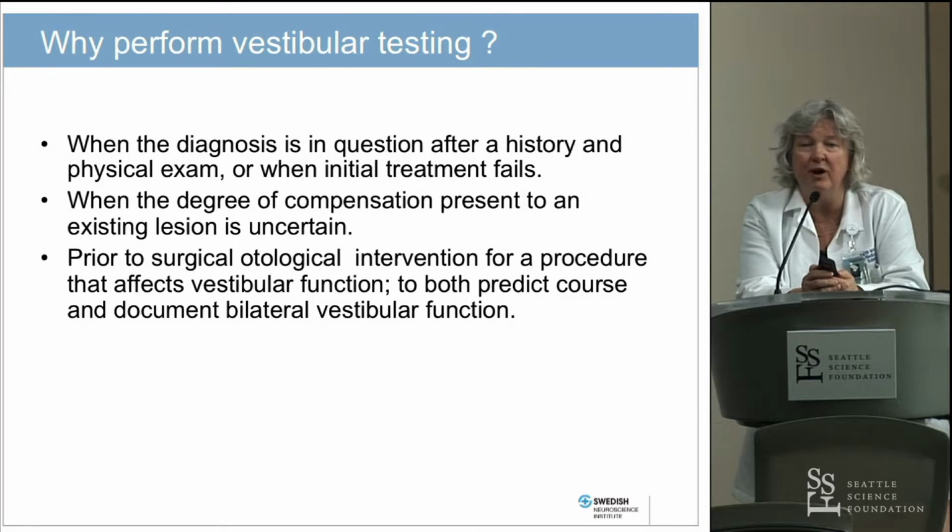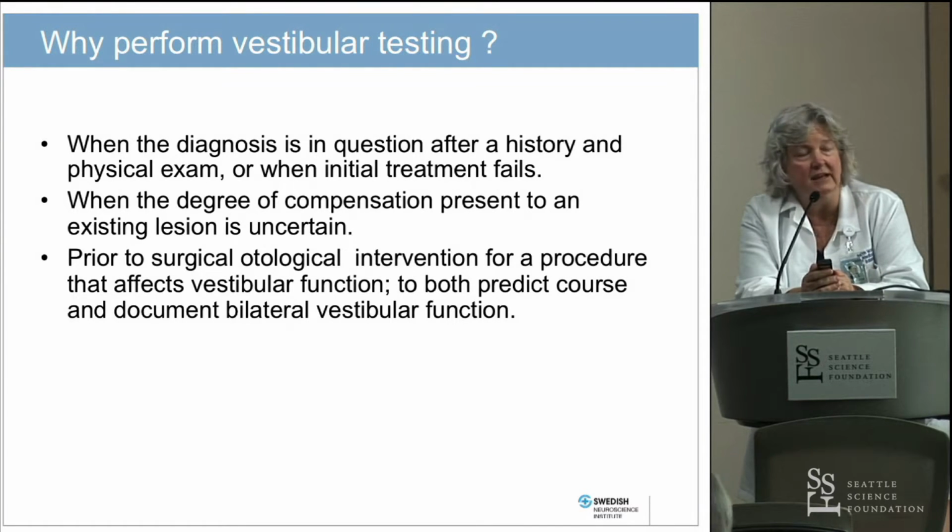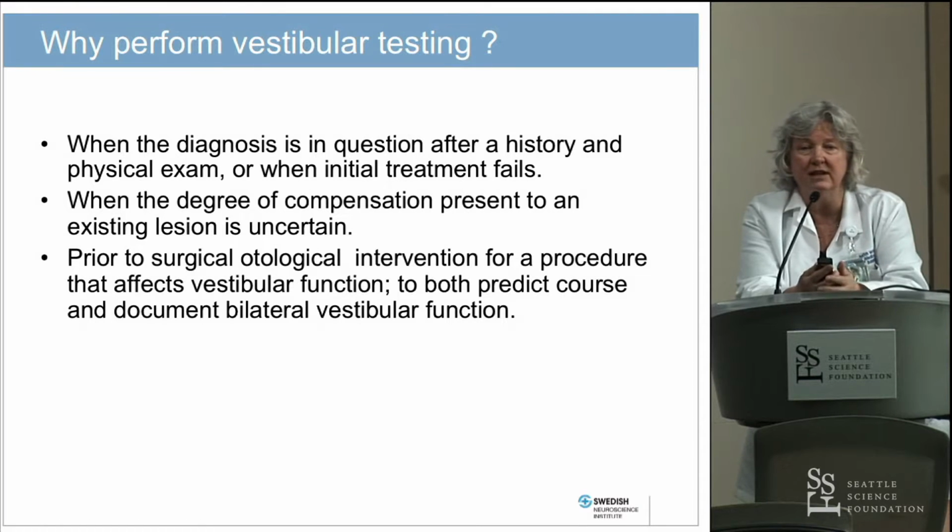Is this a vestibular problem at all? This dizziness the patient's complaining of, could it be migraine? For those kinds of more complex questions, full vestibular evaluation usually comes in handy. But again, it doesn't replace your clinical context, your office exam, and careful thinking about whether you really need to do this or not. The other time when you really might want to get vestibular testing is if you're thinking of ablating an ear, a neuroma, a severe intractable Meniere's. It really helps to know what the function of the good side is.